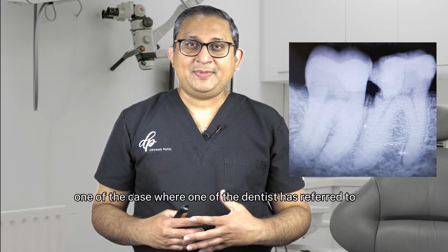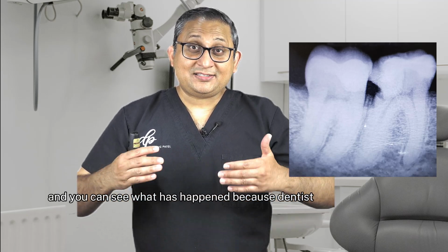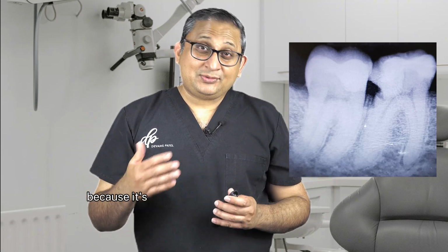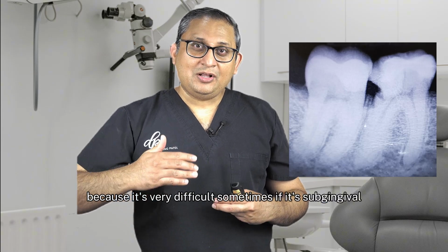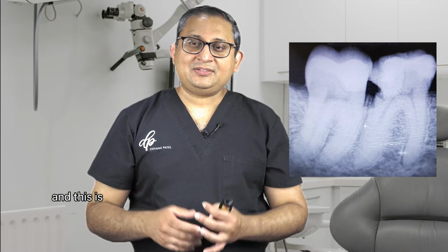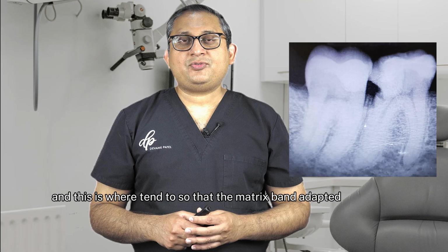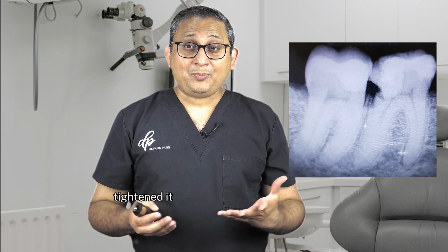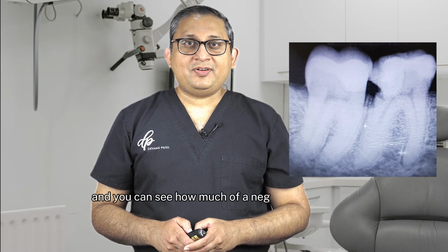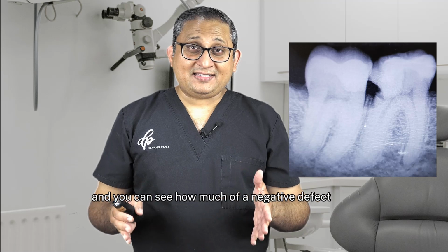And you can see here one of the cases where one of the dentists has referred to me, where the dentist tried to do DME, and you can see what has happened, because the dentist thought that he had really placed the matrix band properly, because it's very difficult sometimes if it's subgingival to see whether you are beyond the box. Okay, and this is where the dentist thought that the matrix band adapted really well, tightened it, probably there was no bleeding, I'm not sure, and then placed some restoration, and you can see how much of a negative defect here is, right?